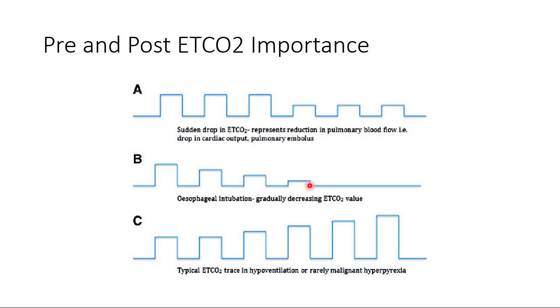if you just look at the first 2 breaths, you might think, oh yeah, it's in place, but this is less than what it should be. Sometimes you may have CO2 in the tube, and CO2 that gets shoved into the gut, and you breathe it out with a couple of breaths. So that first 3 or 4 breaths may be misleading. They will decrease, but they look like a normal waveform. You have to watch for, and I don't have a solid number or data on this, but probably at least 5 or 6 breaths to make sure that your end-tidal CO2 is comparable.